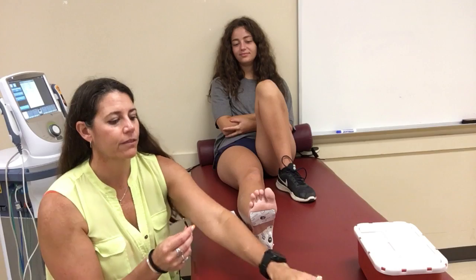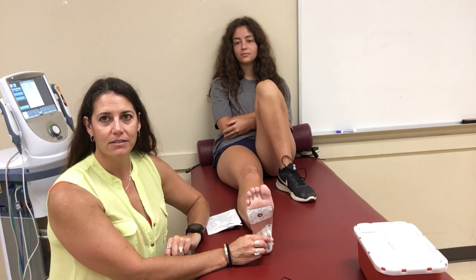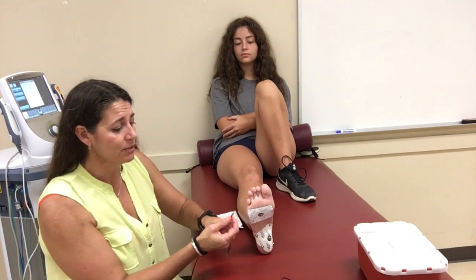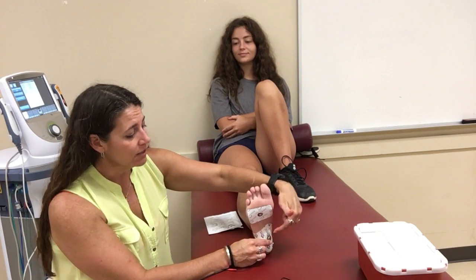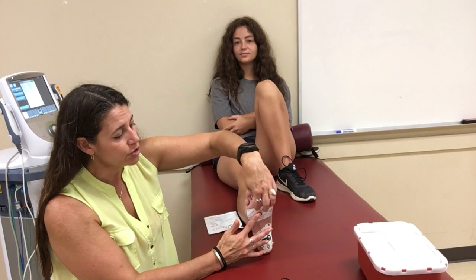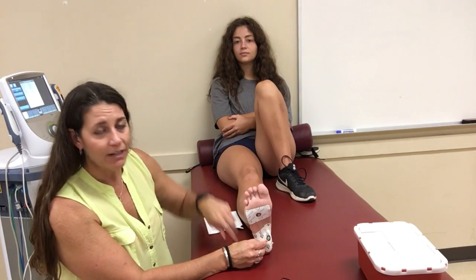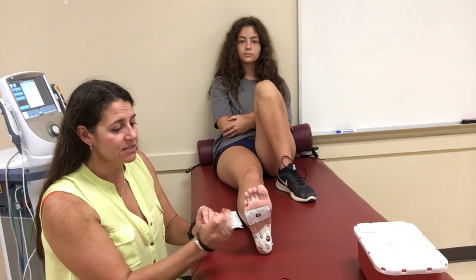People think that's backwards, but think of it like magnets: a positive and negative attract — they go together. A negative with a negative repels. If dexamethasone is a negative drug and you put a positive lead over it, the drug gets attracted into the electrode and stays in the pad — the exact opposite of what you want. You need the negative lead to repel the negative drug into the patient's foot, and the positive lead to attract the drug through the plantar fascia. Otherwise the drug never leaves the active pad and the patient gets no benefit.